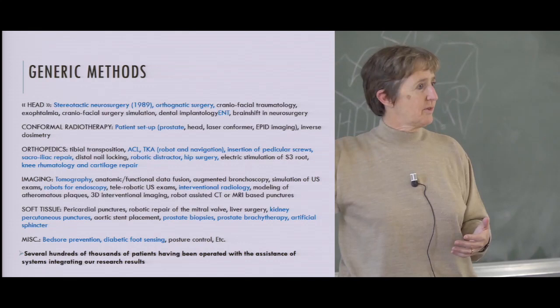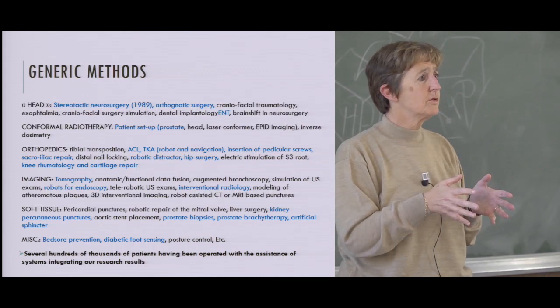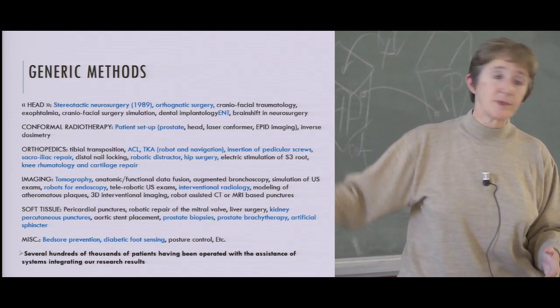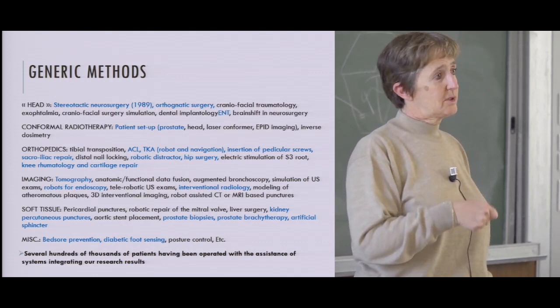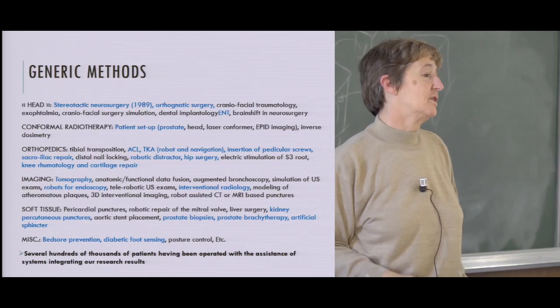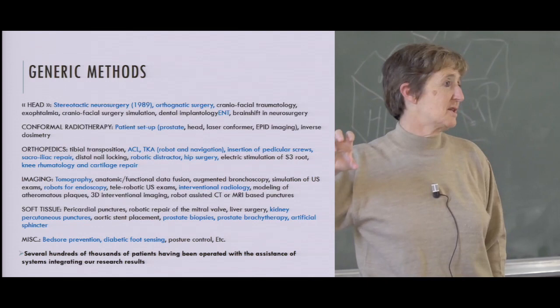So for each of these systems, and this is the clinical part of the work, you not only have to show that your robot is accurate and so on, but you have to show that it is useful from the clinical point of view. And that's an issue that we also have to demonstrate with the clinicians. So, for instance, for prostate biopsy, you can show that you are able to have a better level of detection of the cancer because you are guided using these MR images. Or, the criteria is different for each clinical application. But that's an important question that you need to answer if you want your systems to be used in clinical practice.